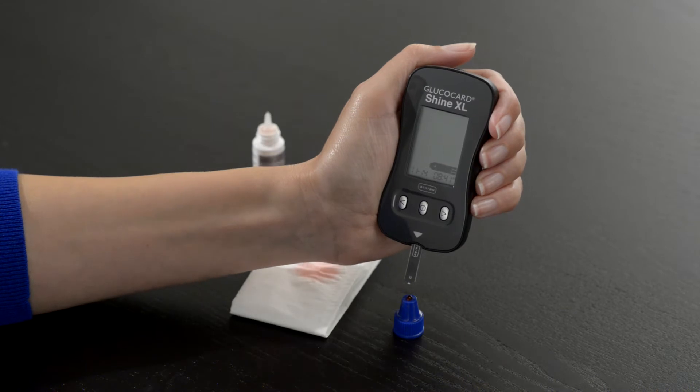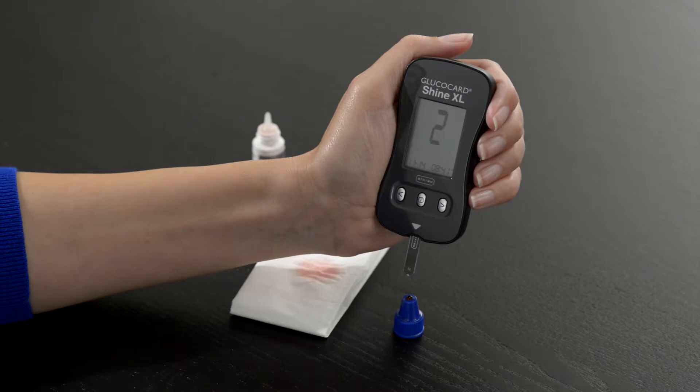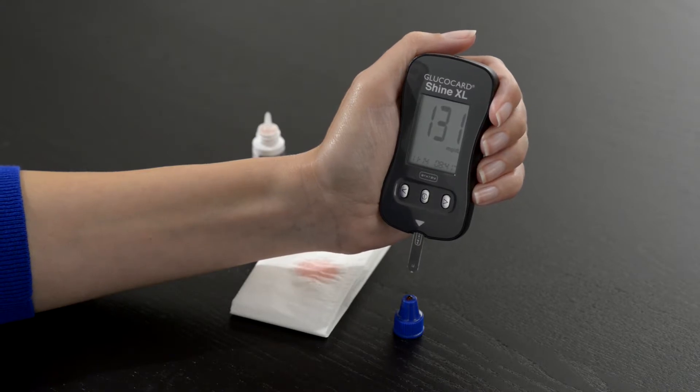Now apply the control solution to the narrow end of the test strip until the meter beeps or begins to count down. Once the meter has finished counting down, the control solution result will appear.